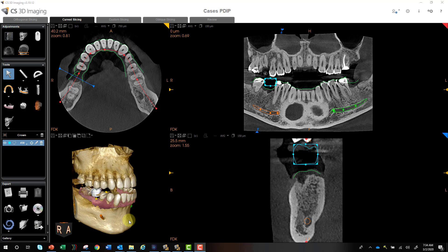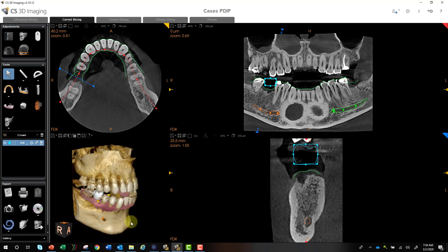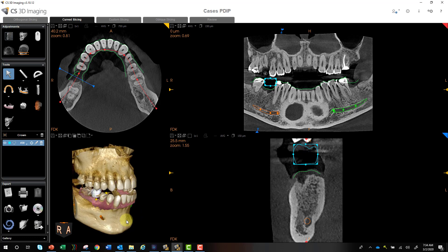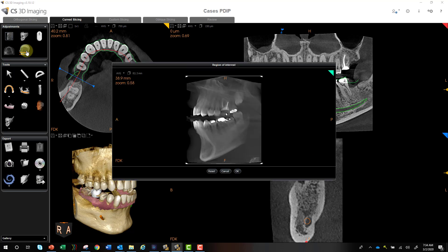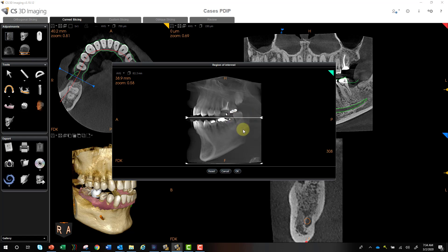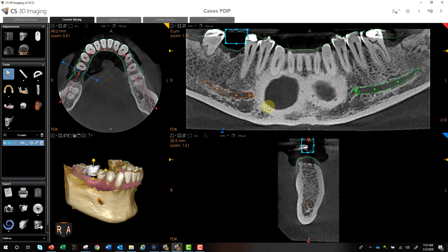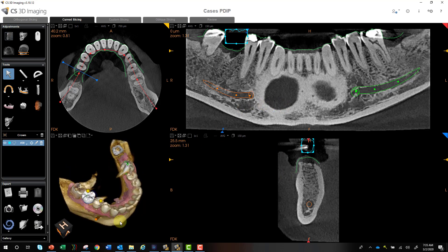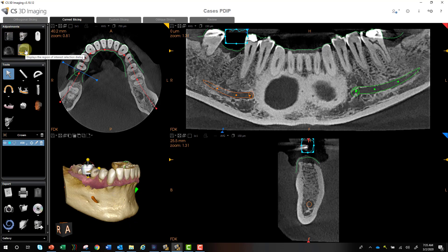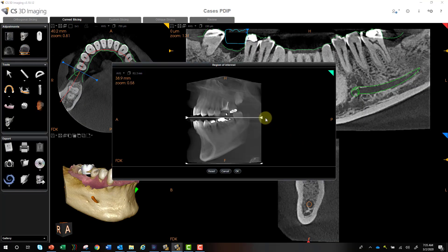This is where using the region of interest tool can be very helpful. Right now I want to visualize and design the crown, but I've got the maxilla in the way. One way to remove the maxilla is to use this region of interest tool in your curve slicing tab and crop out the maxilla. You can see here it's also on this plane, so we're cutting off a little bit of the crowns posteriorly. Select OK, and it crops out the entire image — all your slice views and your 3D rendering — so I can visualize things a little bit better that way.